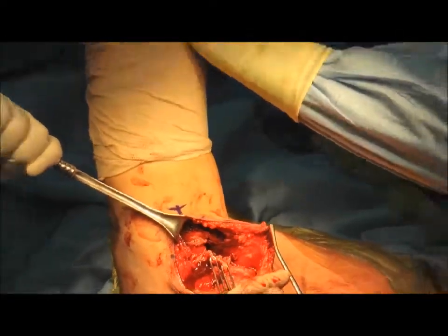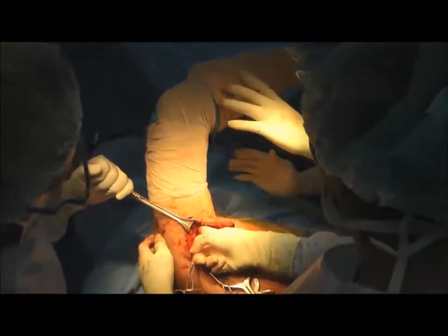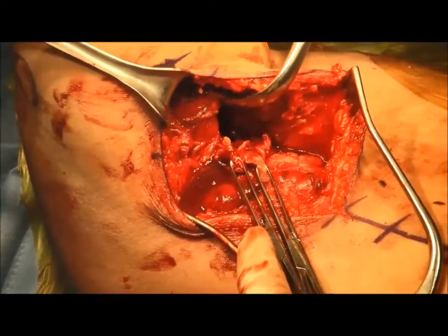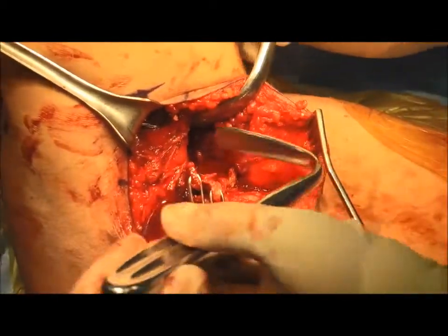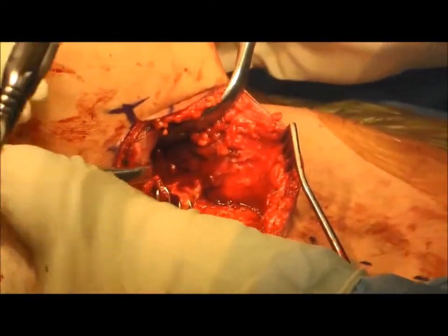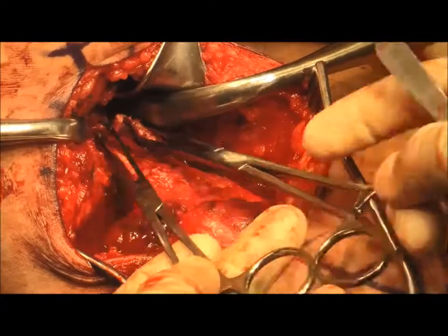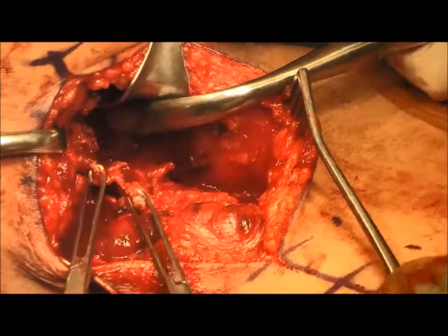Once the tendon is adequately mobilized, the arm is maximally internally rotated to expose the intertubercular groove of the humerus. Right-angle retractors are placed anteriorly on the pec — which also protects the biceps tendon and the radial nerve — posteriorly on the triceps, and at the apex of the incision to facilitate exposure of the footprint. Any stump of remaining tissue on the humeral footprint is debrided, and the tendon is provisionally placed over the footprint to determine if there is adequate mobilization, as shown here.